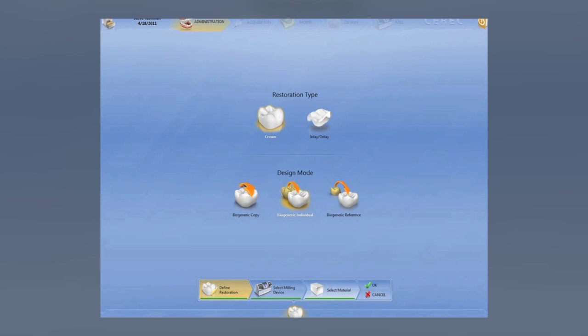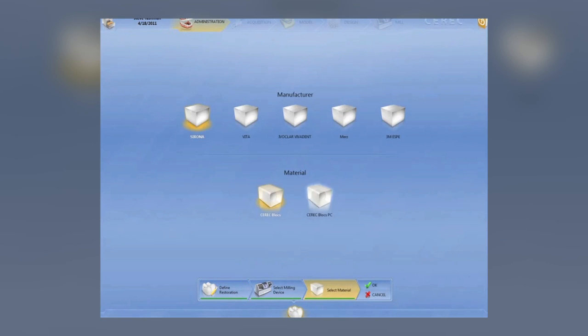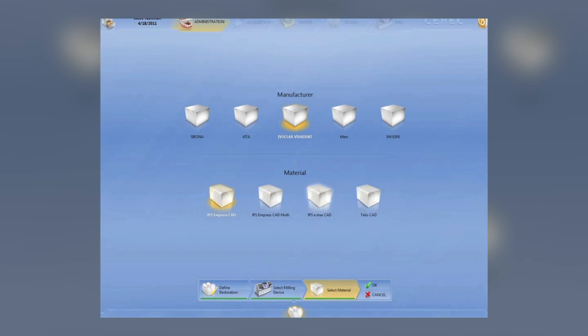As you can see from this pre-release version, we've got a completely new interface where we select the restoration, the type of restoration, the milling unit, the material ahead of time.